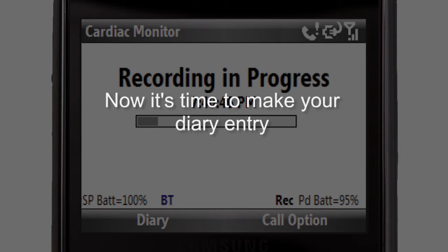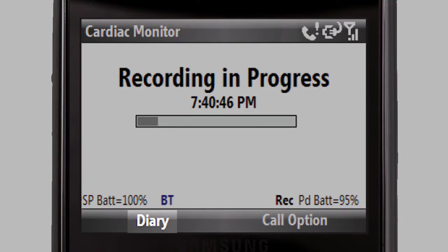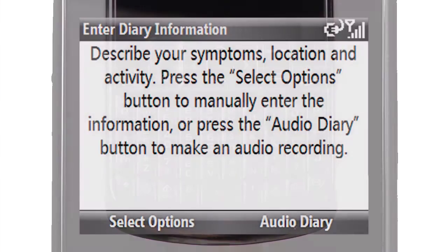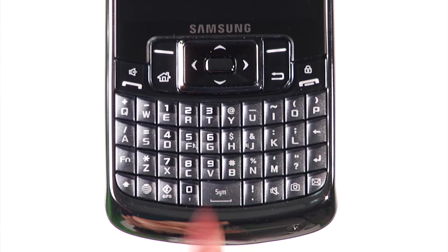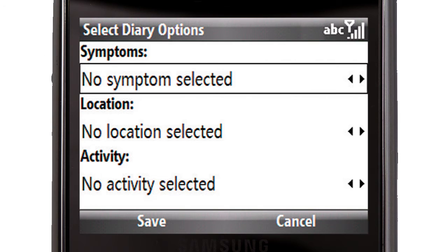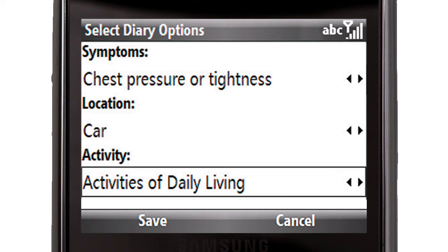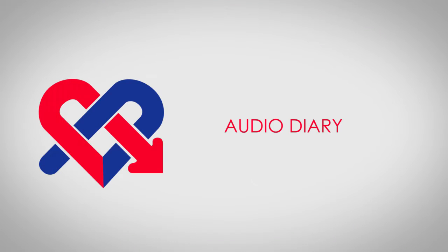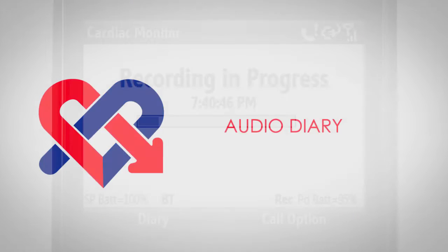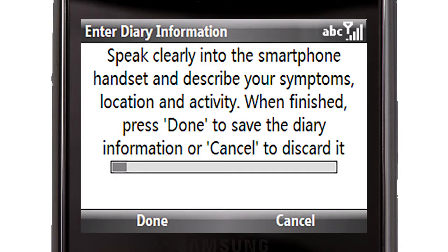Now it's time to make your diary entry. While your ECG recording is taking place, you can input a description of your symptoms into the smartphone's diary. After you initiate the recording of a symptom, select Diary with the left soft key. Press the left soft key again to choose Select Options. Using the arrow keys, you can then select from the list of symptoms. Once you have identified your symptom, press the Select button. Repeat the same steps to choose your location and activity. Then select Save with the left soft key to return to the monitoring display. You also have the option to make a voice recording as your diary entry. Select Diary with the left soft key, then select Audio Diary with the right soft key, and follow the directions on the screen.